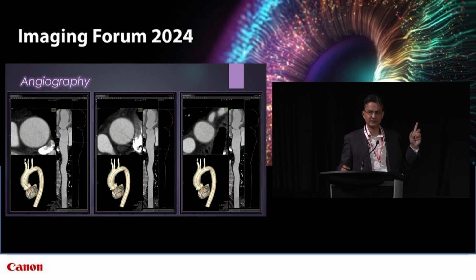And one of the reasons I use this, and you'll see this for the iliofemoral example as well, is it helps generate this curved line on the right of each of these images. Very quickly, you can qualitatively see the luminal diameter of each of the different segments on whichever vessel you're looking at. So for the aorta, where you're looking for the maximum caliber, you can very quickly pick up where it's biggest, and that's where you can very quickly measure relevant sizes.